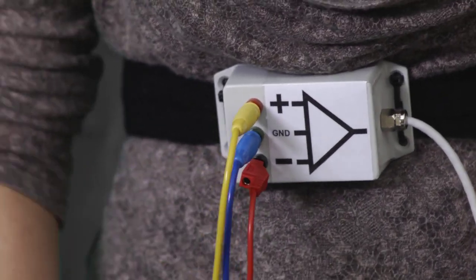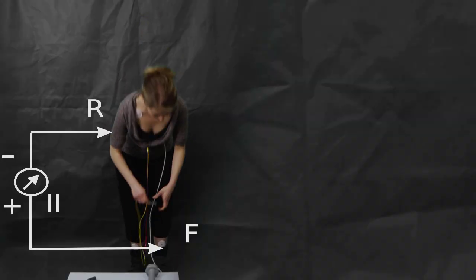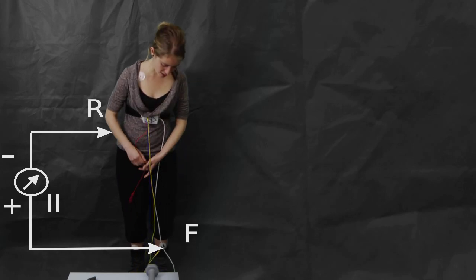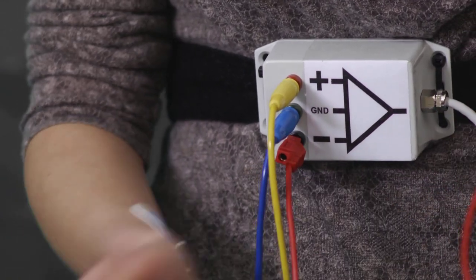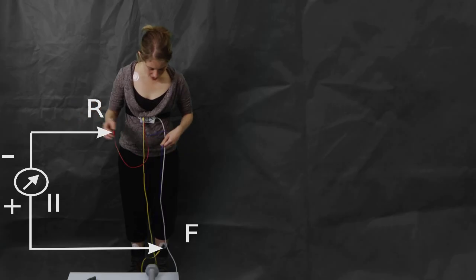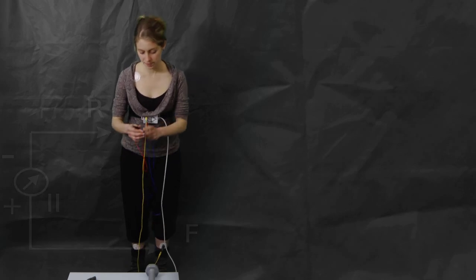So Eindhoven 2. I'll take the positive input and connect it to the left foot. There. The negative input will get connected to the right arm. And ground, or neutral, is always connected to the right foot. There.